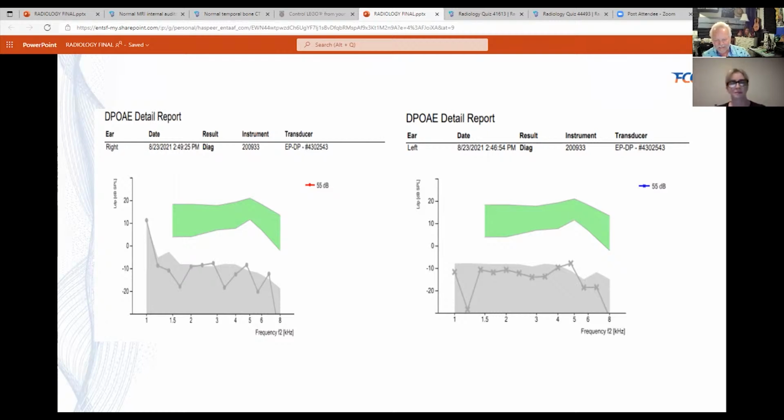And the only other thing, because again, we're a little short on time, is that it's excellent, and it's how most centers are measuring newborn hearing. Isn't that right? Correct. Because it is faster than doing the ABR, which is a lot of times done in hospitals. This is a very quick way of getting a response. Yeah, so a newborn should have normal responses here. And if not, then they need to be referred on for further testing.